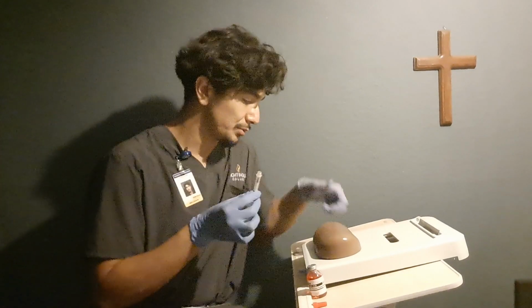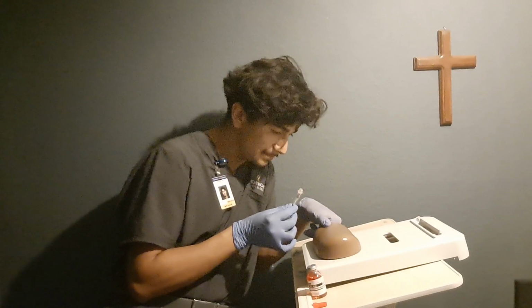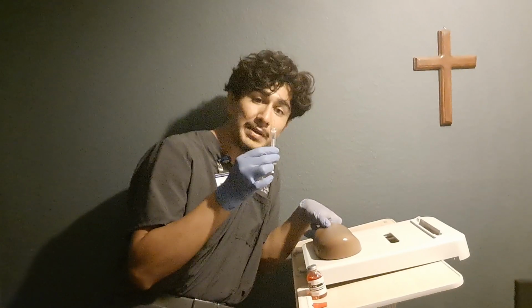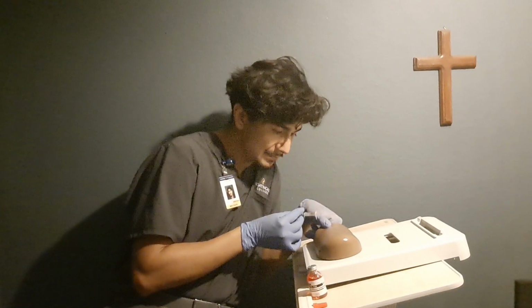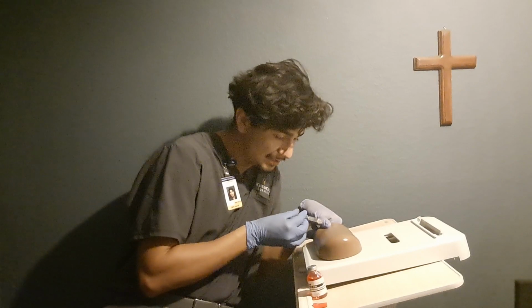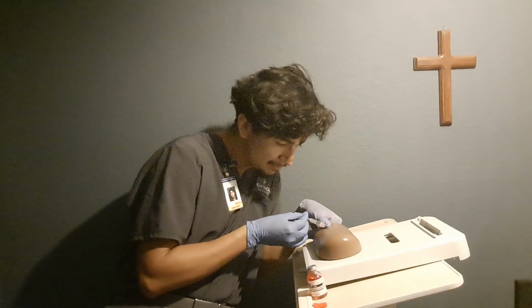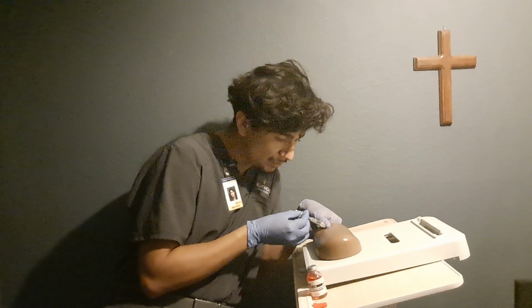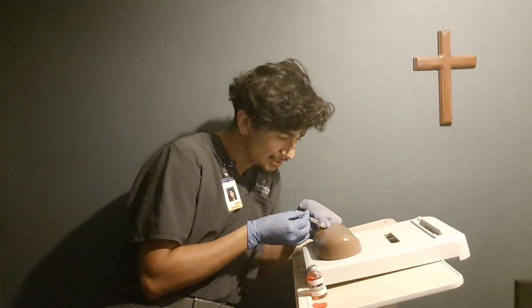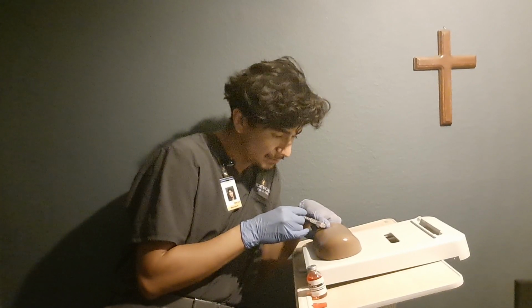With our thumb, we're gonna pull back on the skin. We're gonna pull back on this patient's skin. We're gonna make sure that the bevel is facing up. And then we're gonna go in at a 5 to 15 degree angle. Okay, and then once we feel some resistance, we can go 1/8 of an inch into the epidermis. Okay, and then we're gonna slowly inject the medication.